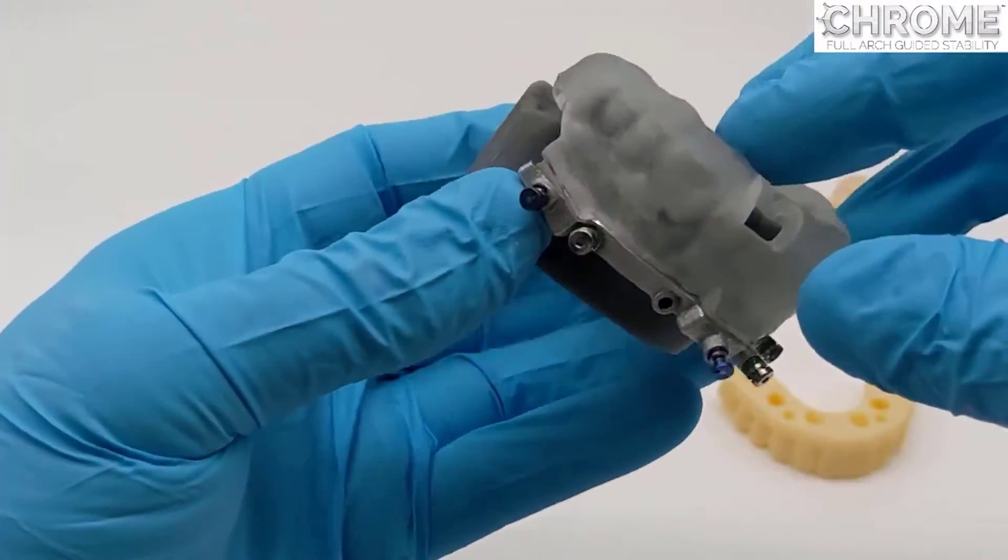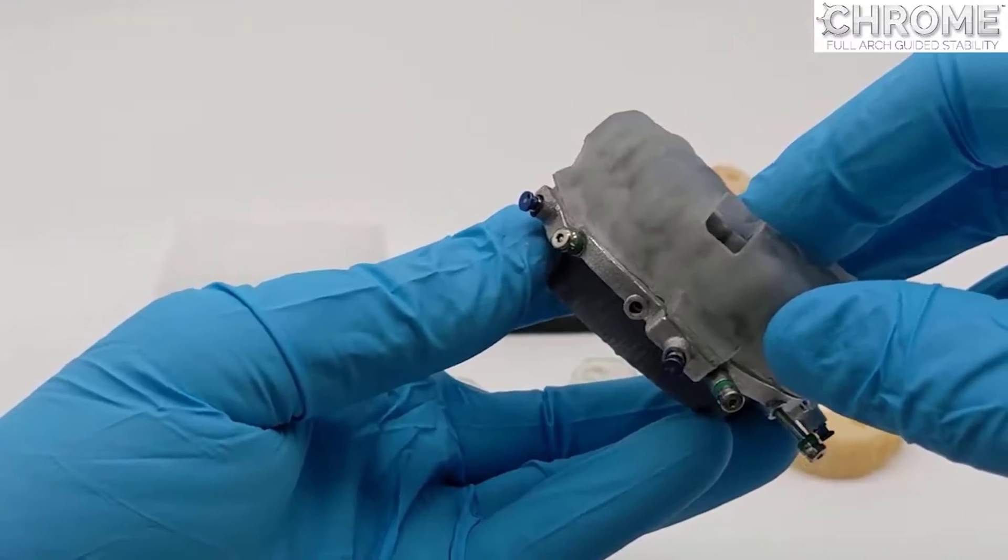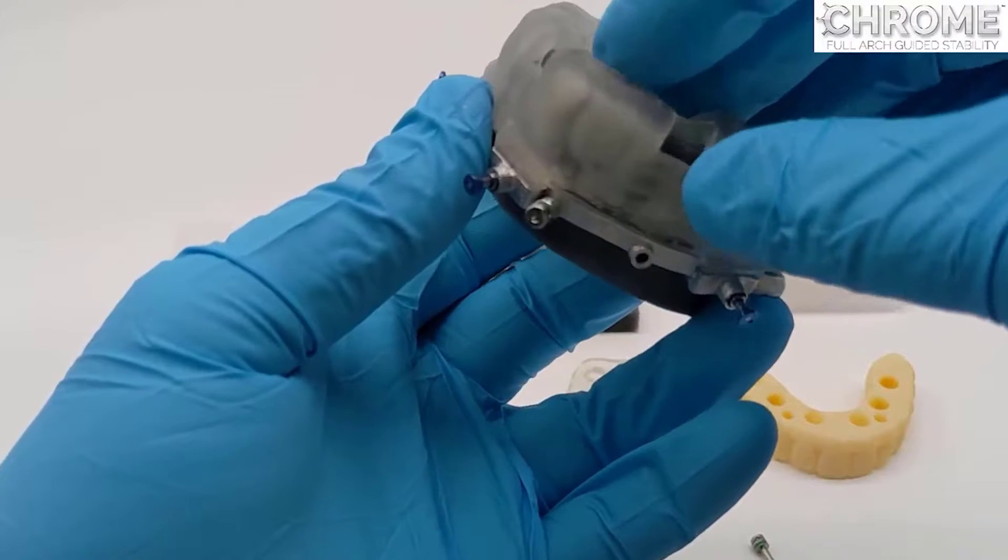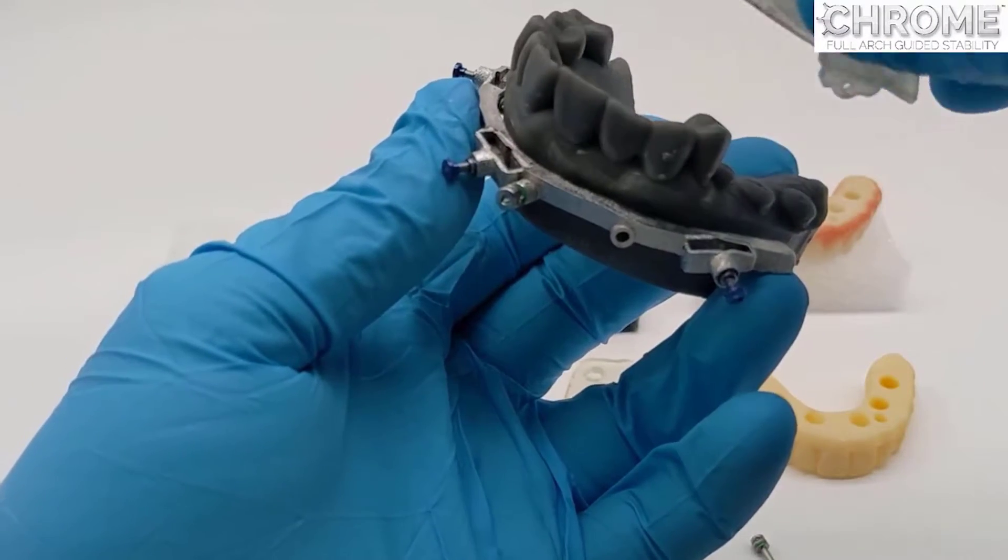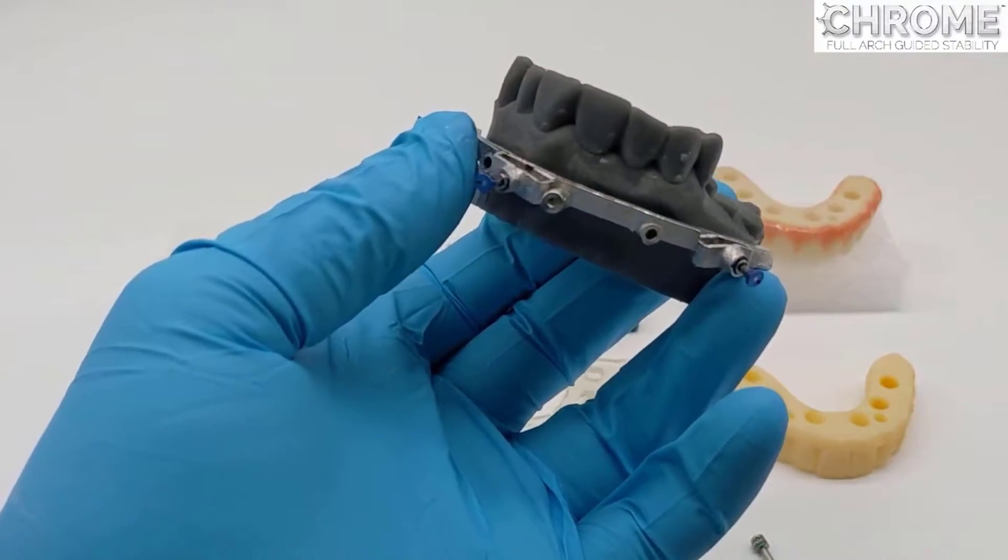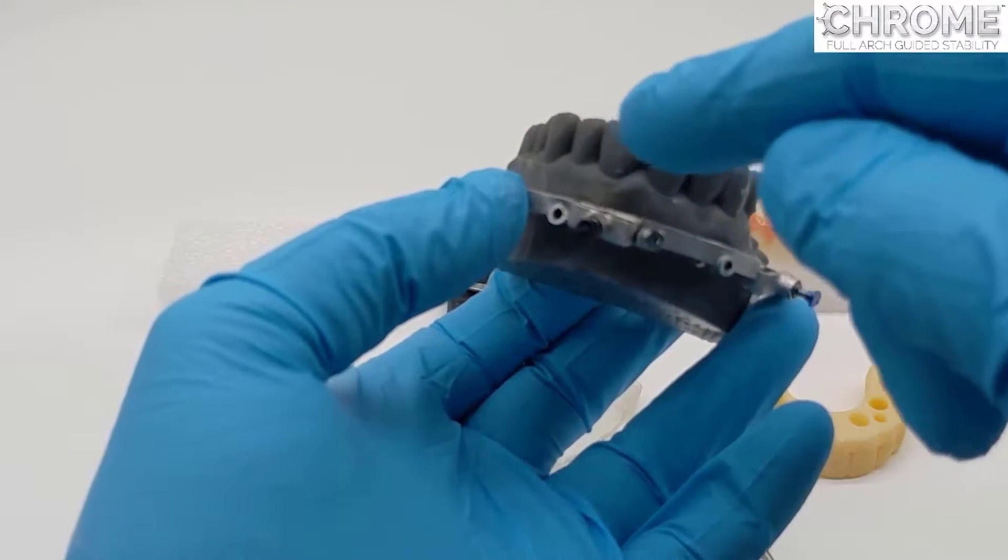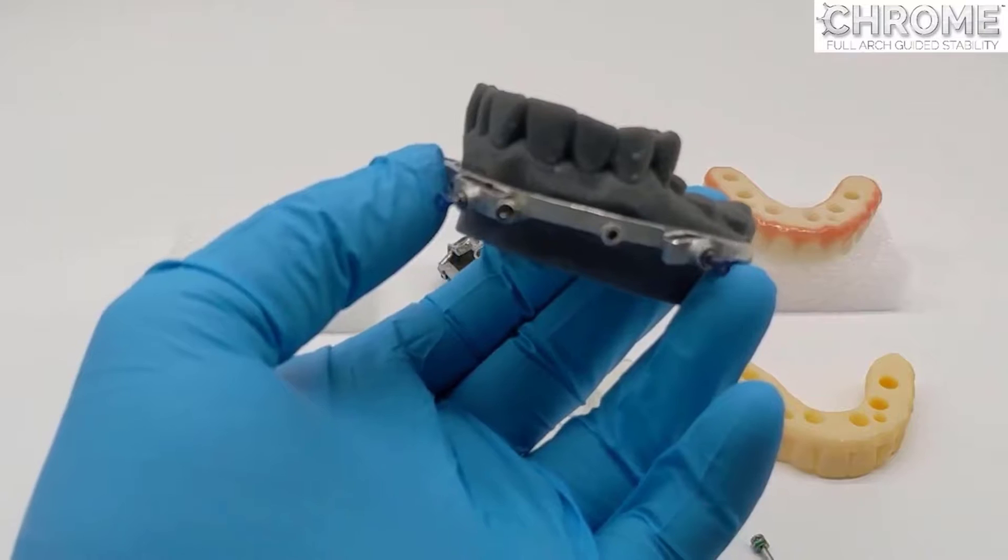The pin guide is then removed from the fixation base, and in this particular form of Chrome, all the bone and teeth above the fixation base are reduced.